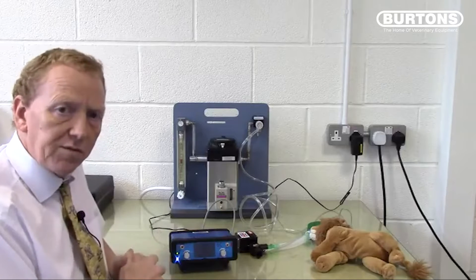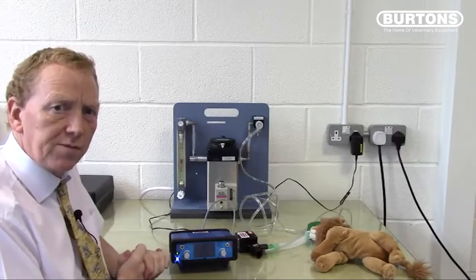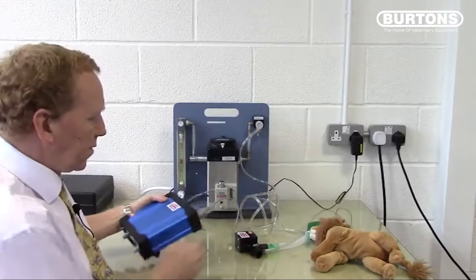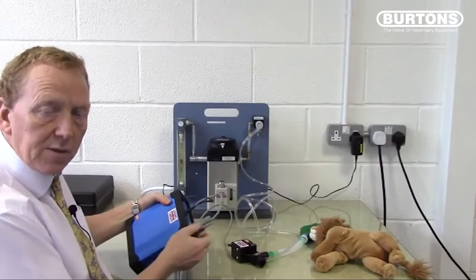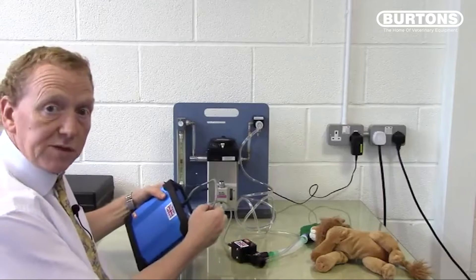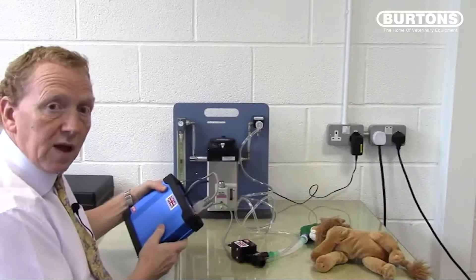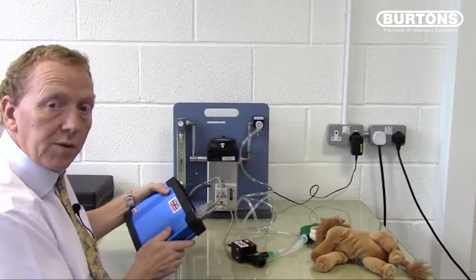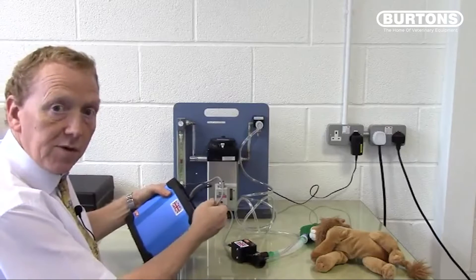Starting with the valve connection, as this is often a source of confusion: the SAVO4 has a single valve which connects into the back using a 9-way D-type connector. These connectors must be screwed tight to avoid dislodging during surgery. If it does become dislodged, there is an alarm or sound to alert you, but it's good to have these tightened up before you start.